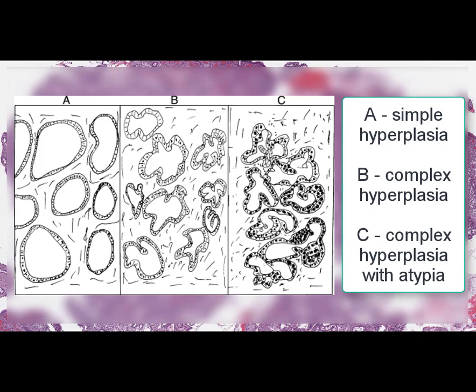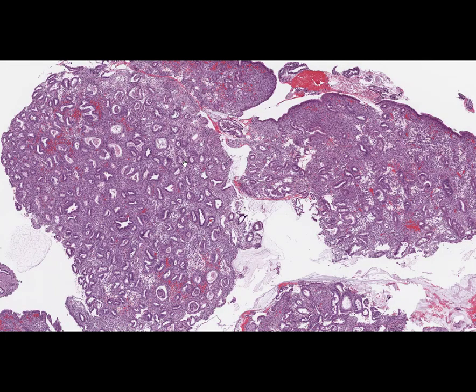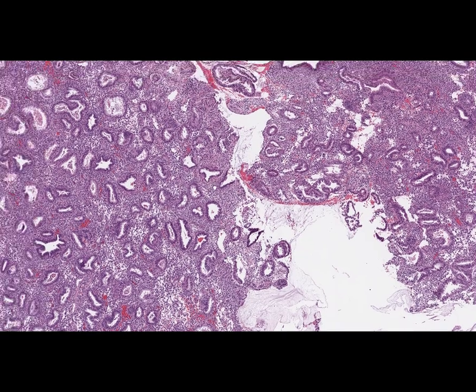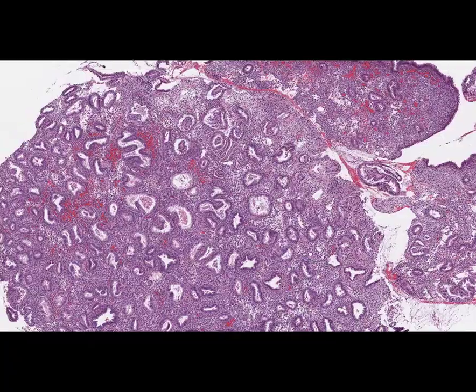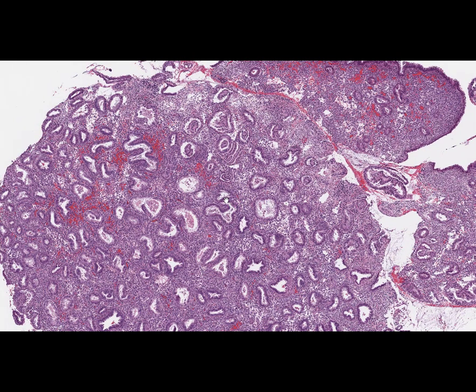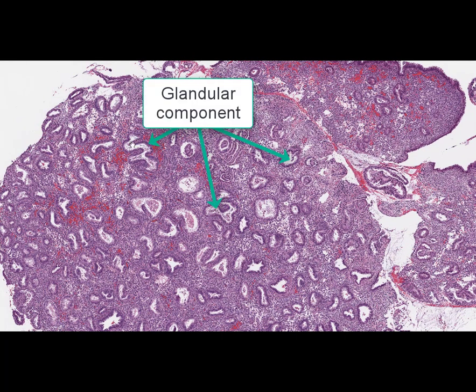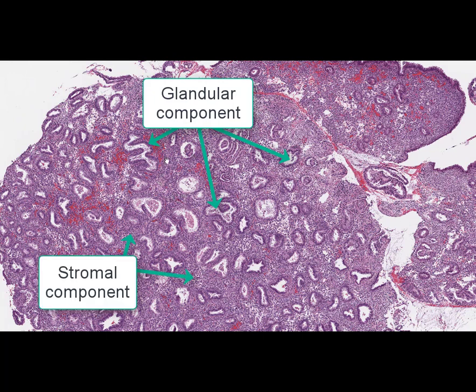The changes are divided into simple and complex types, and they can be with or without atypism. In this slide, we can see a pattern of complex endometrial hyperplasia without atypism. At low magnification, the two basic components of endometrium are clearly seen: the glandular component and the stromal component, where the glandular component is increased and occupies the greater part of the histological section.